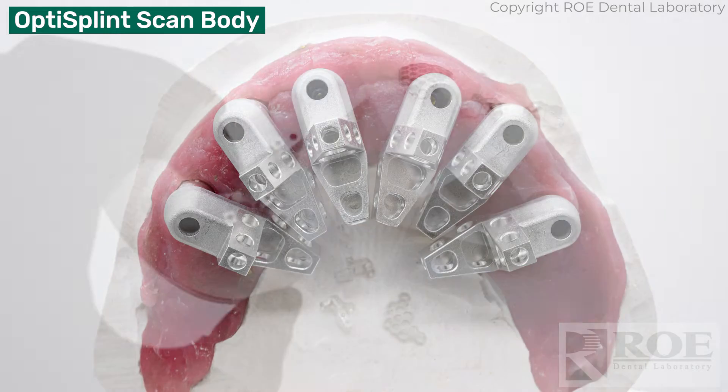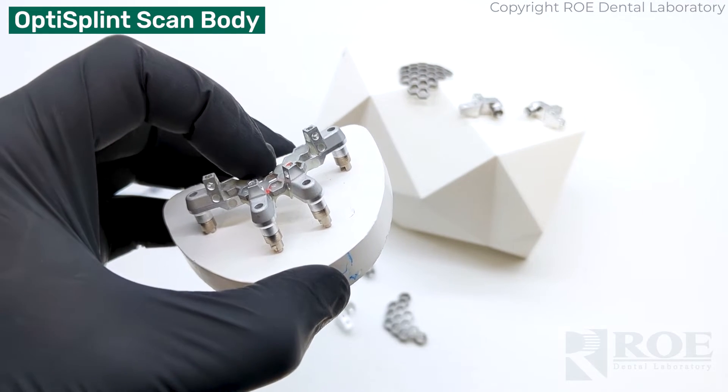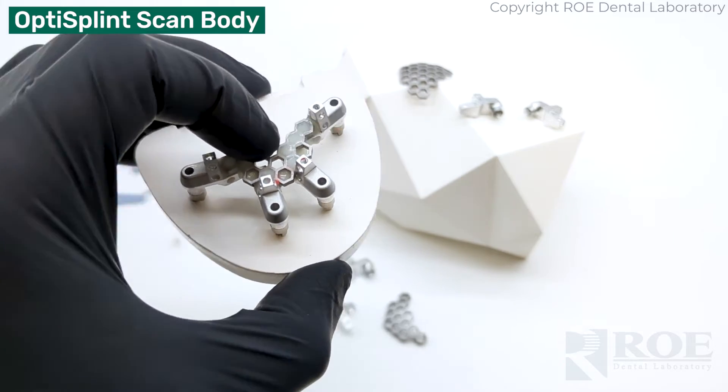The scan bodies are all placed on multi-unit abutments, luted together in the mouth, and scanned with your iOS scanner. That's the primary function of this kit.